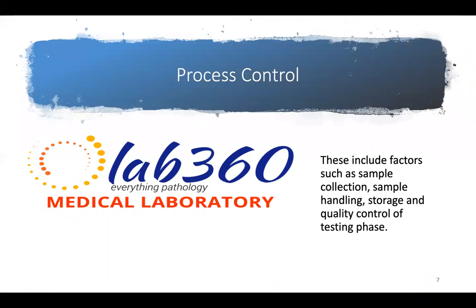Now we've talked about reagents. Now we're looking at process control. Your equipment has been set up within a facility. You've got your reagents properly managed. Now you need to run your patient samples through the equipment that has the reagents. So firstly, the samples must be collected properly.